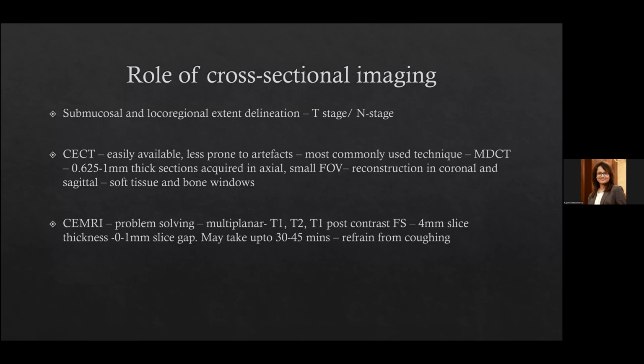For example, if you want to rule out any prevertebral fascia invasion, or we want to rule out any subtle cartilage involvement, then we can do a contrast enhanced MRI. For all practical purposes, CECT is the ideal modality of choice for imaging of larynx and hypopharynx.